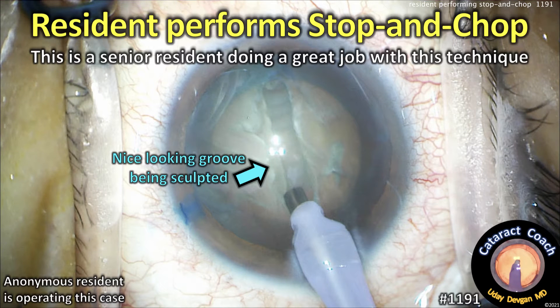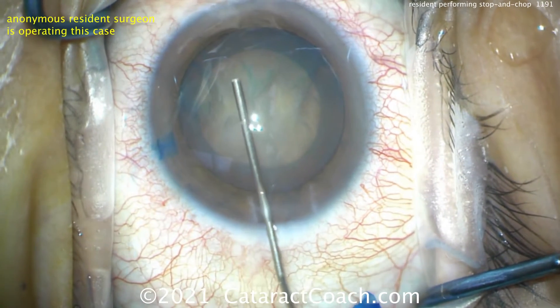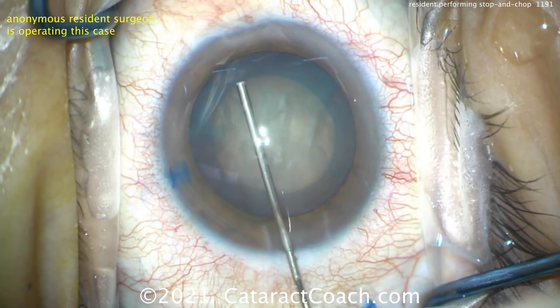CataractCoach.com — a resident performed stop-and-chop. We have a senior resident here who does a great job with this technique. We're going to show you the sculpting part of it and the nucleus removal in real time, and then we'll speed up the end of the case.